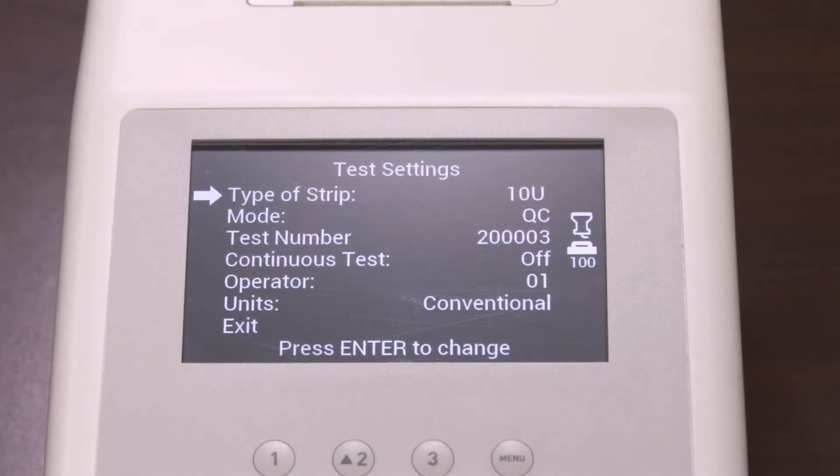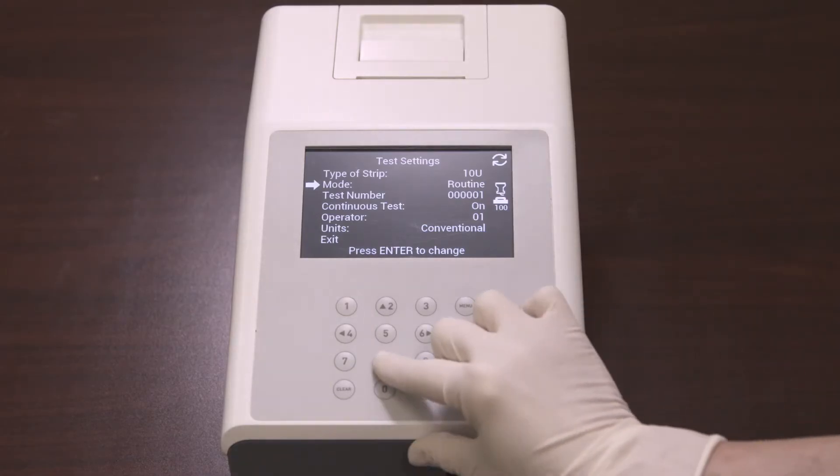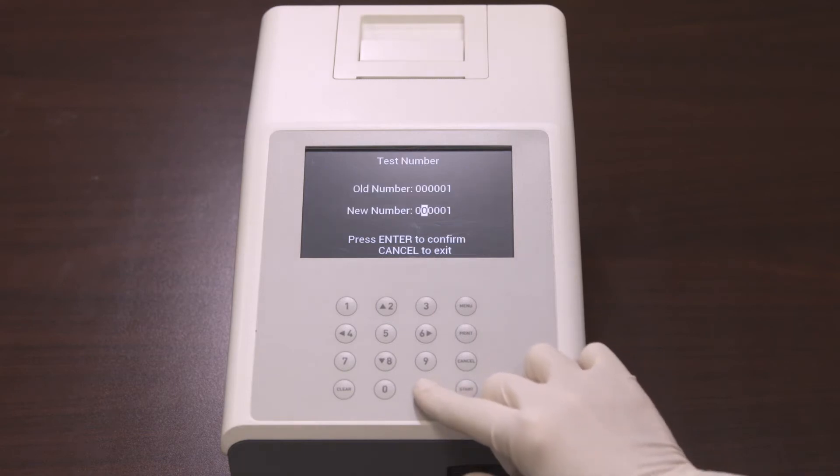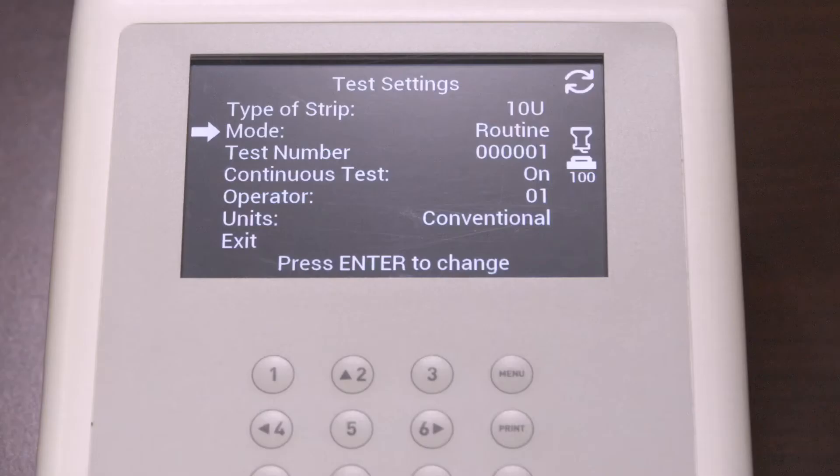After selecting the type of strip, select the mode and press Enter to change the mode. There are three test mode options: Routine test, which is used for normal urine testing; STAT test, used for emergency urine testing; and QC test, used for testing positive or negative controls. You can also select the test number and enter a new test number, then press Enter to confirm. The first digit in the number will depend on the test mode: zero for routine, one for STAT, and two for QC test.